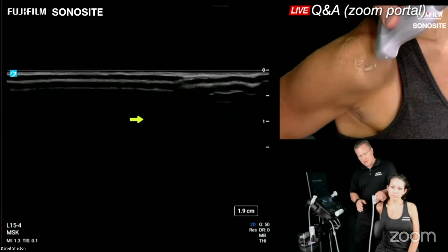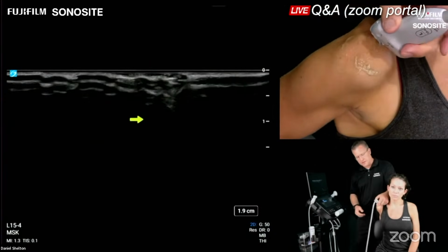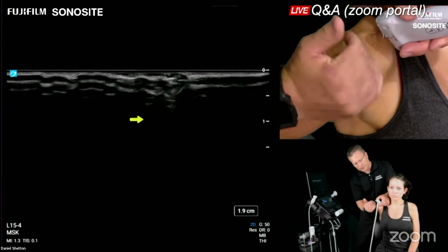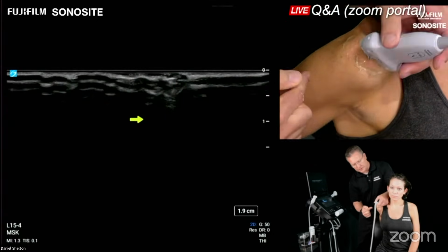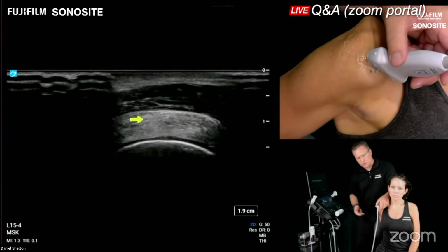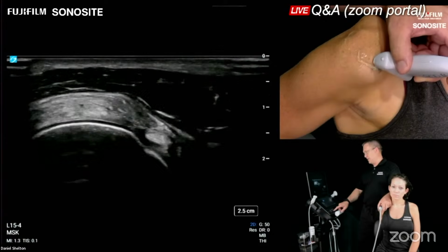Most people like to just go ahead and plop the probe onto long axis and just get right to the point. Well, that's fun. That's okay. We're here to learn the scanning techniques of how to do this fairly thoroughly. And I'm going to go short axis first. So remember the anatomy diagram, we've pulled the structures anteriorly and inferiorly. I'm going to take this slice right here across that anterior humeral head, putting the medial side of the probe towards the chest wall, almost touching it completely. In fact, in this case, I am.